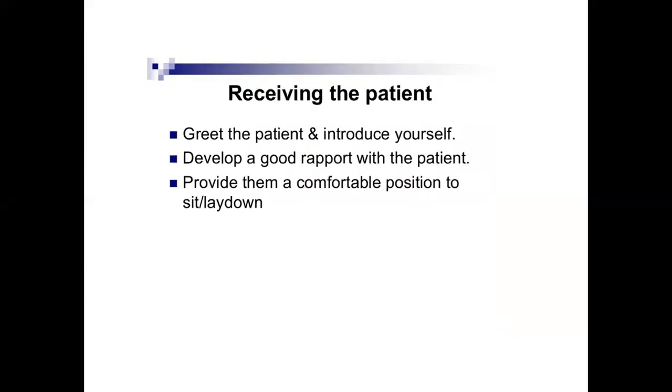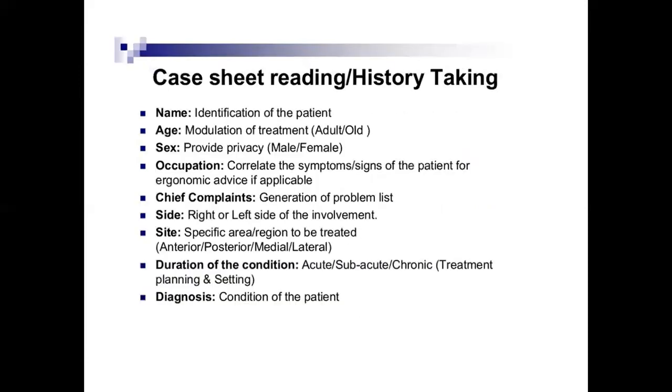Receiving the patient. We greet the patient and introduce ourselves to develop a good rapport with the patient. We provide them a comfortable position to sit or lie down. Case sheet reading or history taking. We take the subjective assessment of the patient, starting with the name, identification of the patient, age, the modulation of treatment, to provide privacy. Occupation, correlate the symptoms and signs of the patient, for ergonomic advice if applicable.